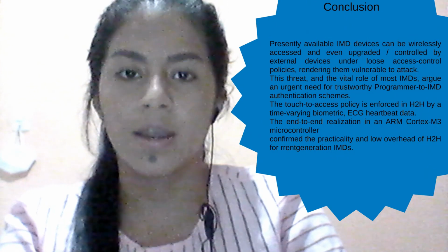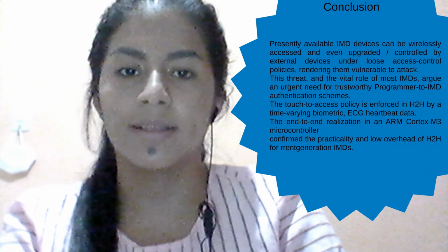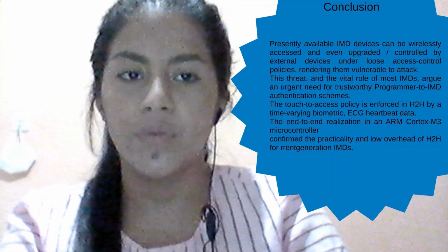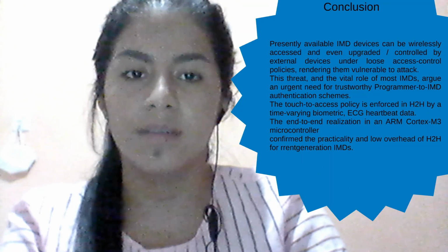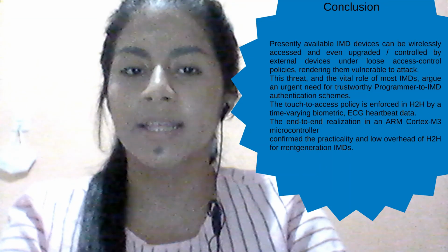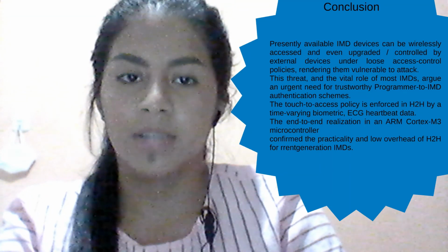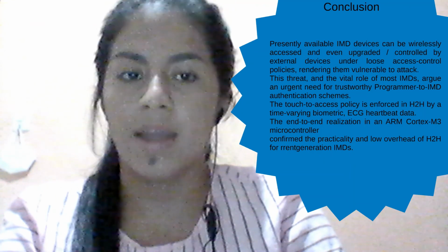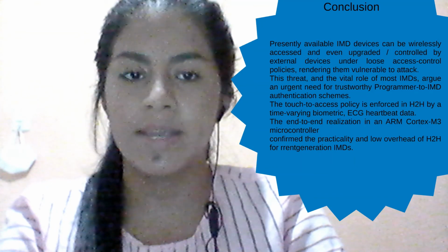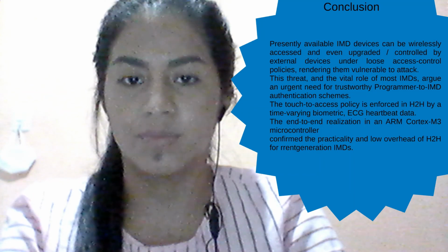Conclusion. Presently available IMDs can be wirelessly accessed, and even upgraded and controlled by external devices under loose access control policies, rendering them vulnerable to attack. Given the vital role of most IMDs, there is an urgent need for trustworthy programmer-to-IMD authentication schemes.